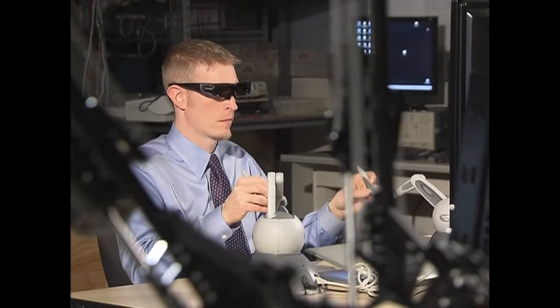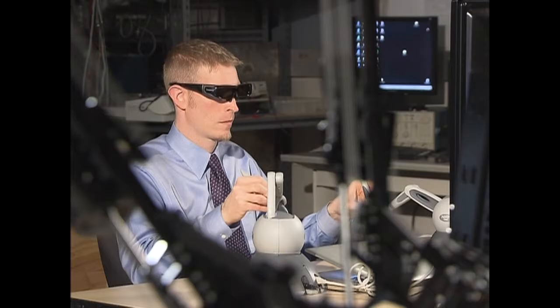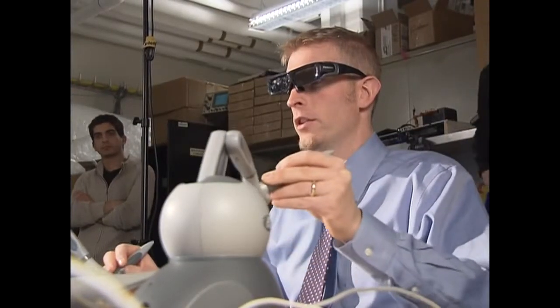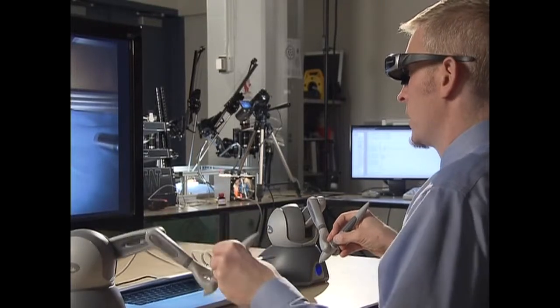Dr. Tom Lindvay is one of the surgeons working with the Raven team. He regularly uses robotics to perform surgeries inside the body cavity using minimally invasive incisions.